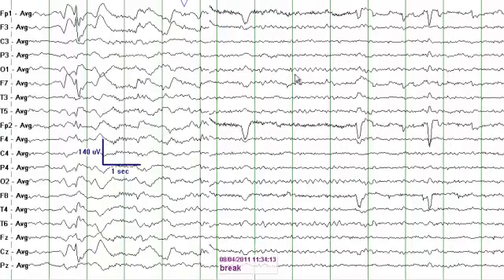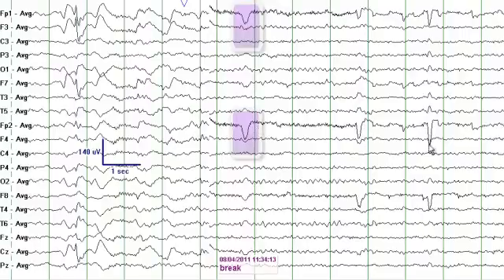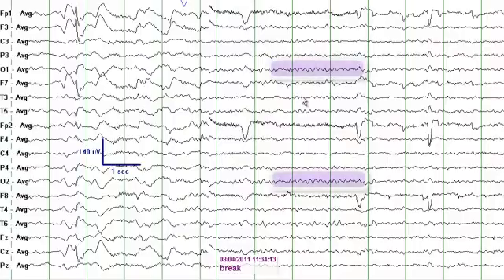Now you see a posterior dominant alpha rhythm, close to 7 to 8 Hz, indicating the patient is awake, with visible eye blink artifacts. To determine wakefulness versus sleep: look for muscle artifacts (a small amount is seen in the frontal region), eye blinks (visible here, though rapid eye movements can also occur in REM sleep), and a posterior dominant alpha rhythm. These features together are suggestive that this person is awake.